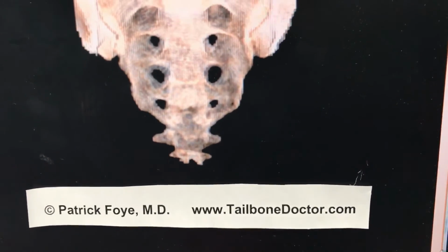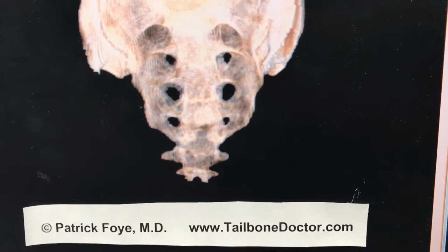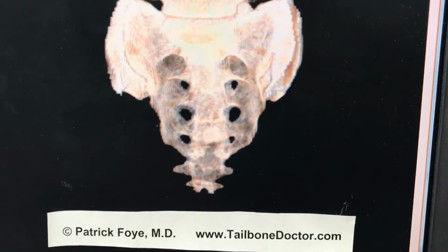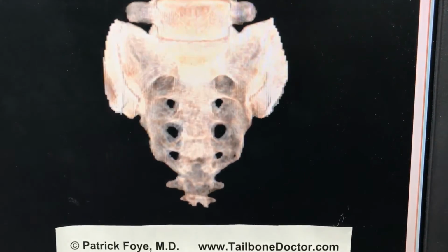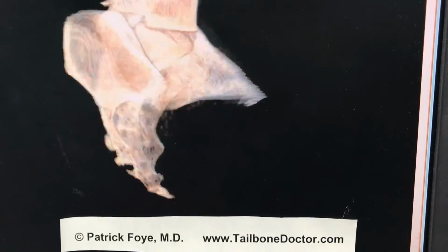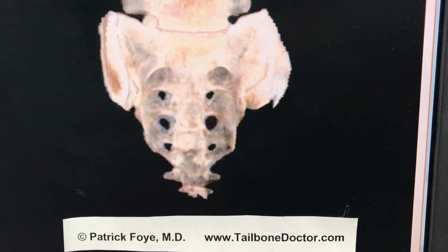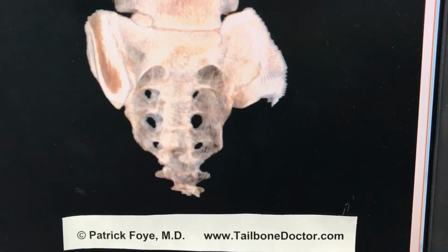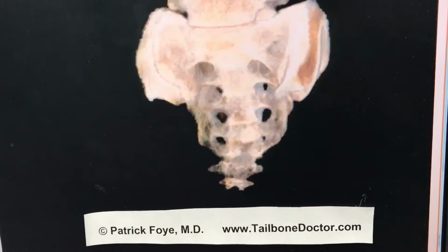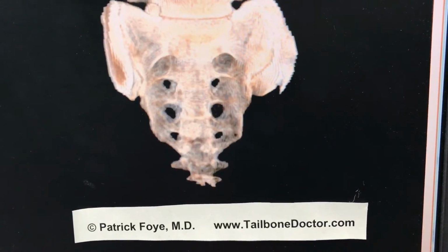So again, this is maybe 1% of patients I see for tailbone pain here at the Tailbone Pain Center that I end up ordering this type of study with the CT scan with three-dimensional or 3D reconstruction. It's very cool technology, but I only use it in very selected cases who have a specific question anatomically that we were unable to answer from the regular imaging studies such as X-rays and MRI.